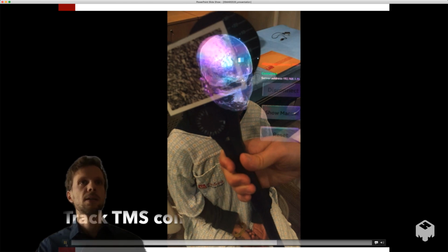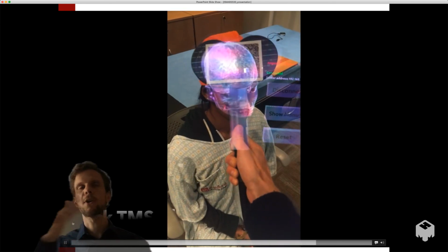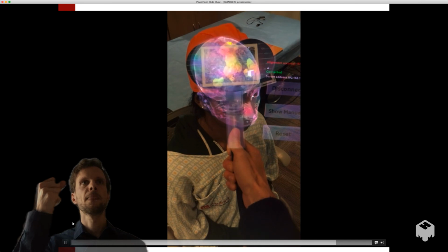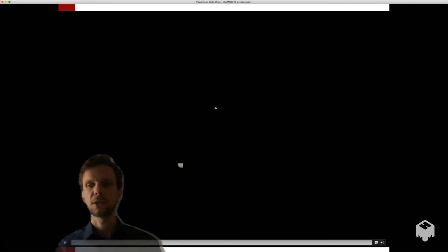So let's keep the video rolling again. Now you see one example of what you could do. Once you place the coil close to the subject's brain, we could see, for example, functional networks that would be targeted for a certain coil position.